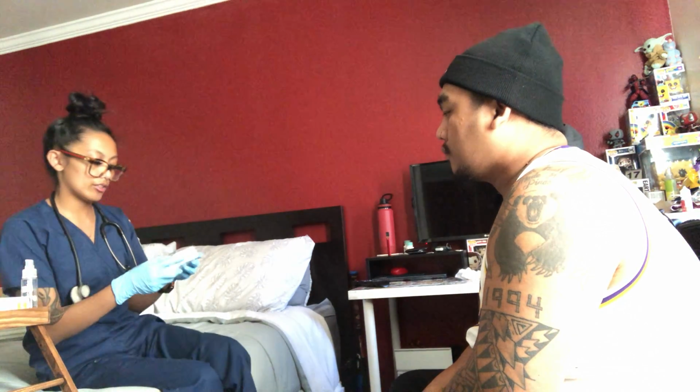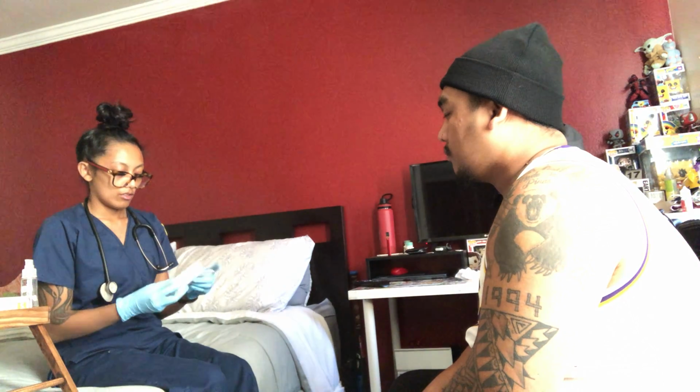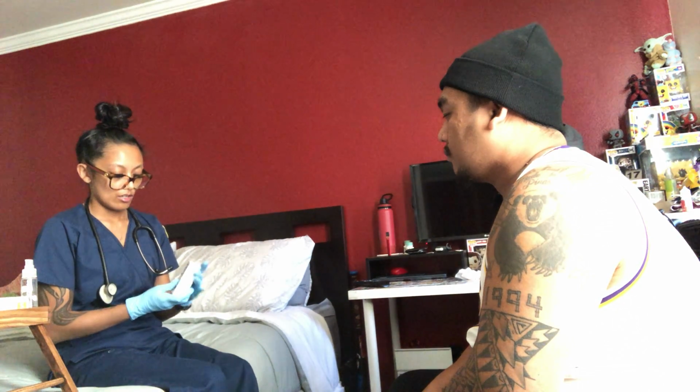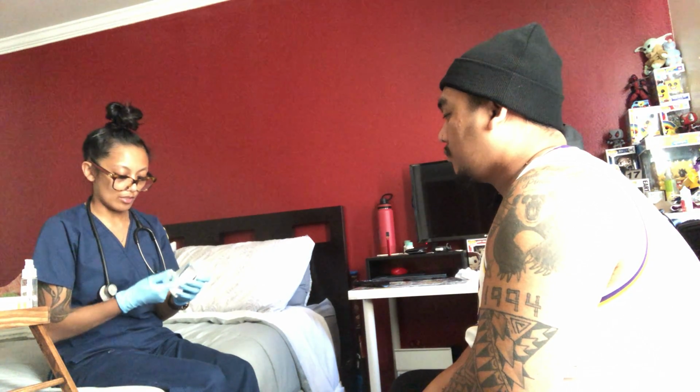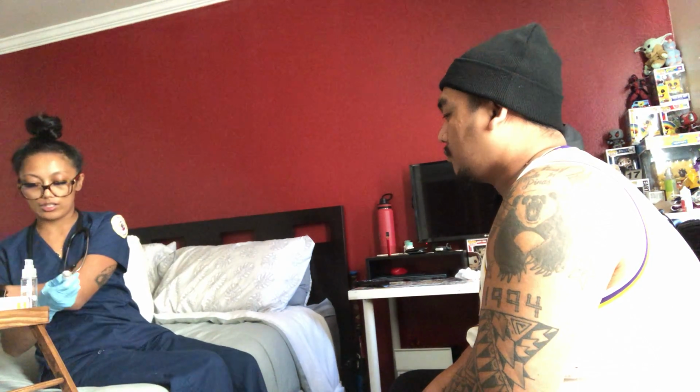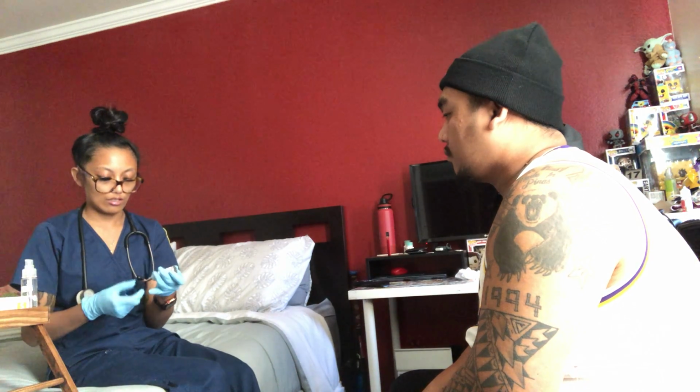So I'm going to first start off by showing you how to use your albuterol inhaler. This is your albuterol inhaler. This is to help open up your airways. I just want to make sure that this is the right medication inside the box and that's on the box, and that it's not past its expiration date. I'm just going to put it in my hand to warm it up and shake it a little.